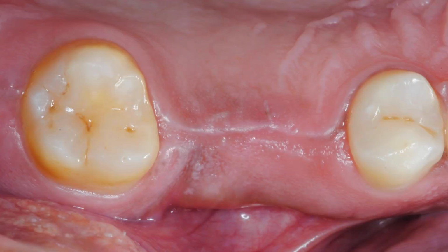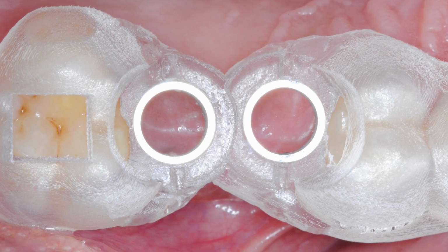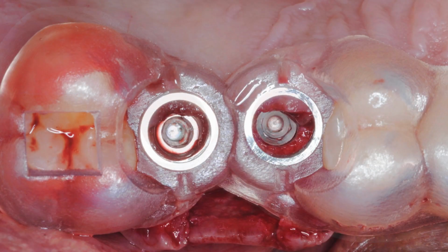But if for whatever reason your experience level is not at that point at this moment in your clinical practice, then please always decide to go with a fully guided protocol, even if it's a single tooth. And if it's going to be two neighboring teeth, I highly recommend that fully guided protocol, because it's going to give you the right angulation, the perfect location, the right axis location of both of those implants, and most importantly, it's going to help you guide the full depth of your implant so that you have that more natural emergence profile.